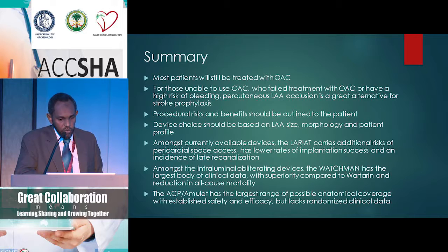And amongst the intraluminal obliterating devices, the WATCHMAN has the largest body of clinical data with superiority compared to warfarin and reduction in all-cause mortality, while the ACP or Amulet has the largest range of possible anatomical coverage with established safety and efficacy but lacks randomized clinical data.